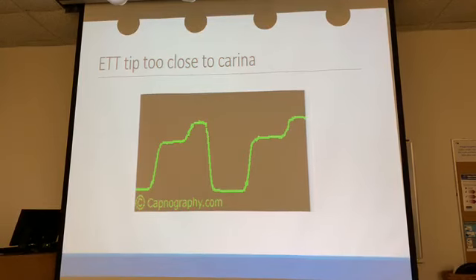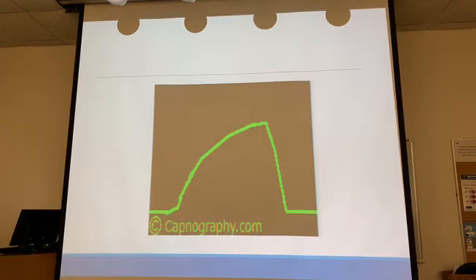So, you know, you're gonna see an end-tidal CO2 waveform when you hook them up that they never saw, and you see something like this or a funky waveform, you probably need to be like, hey, can y'all check that too, because this waveform isn't right. And what this is, the patient is intubated, but they've intubated too deep. They're slightly on the right main stem, and what you're seeing is this is the right lung exhalation, and then you see this because this is from the left lung. You're not getting both lungs exhaling the carbon dioxide at the same time through the detector. You're getting this kind of humpback feature there.